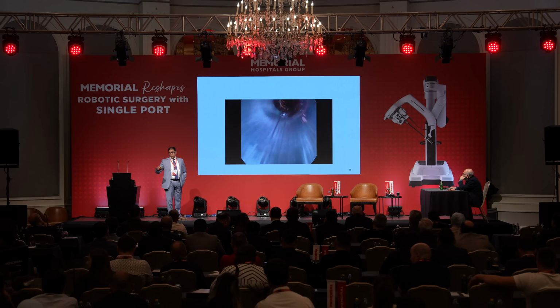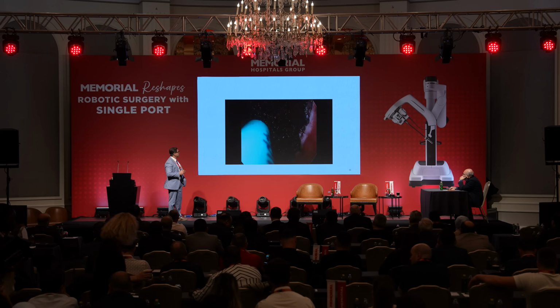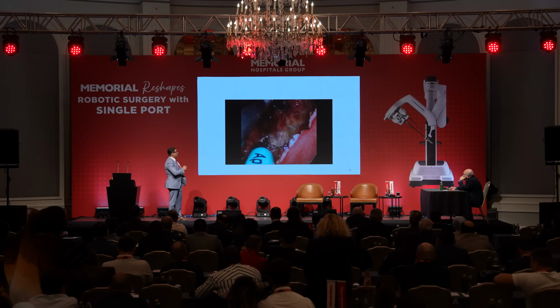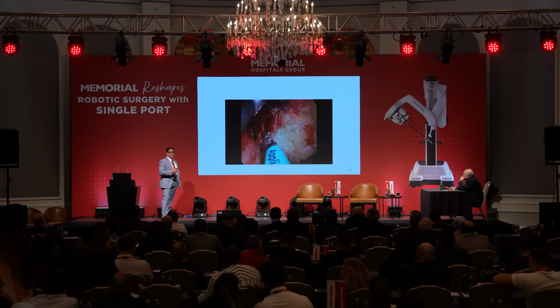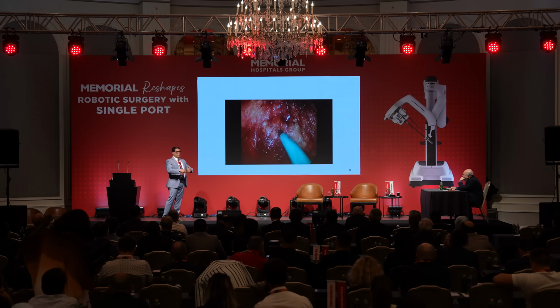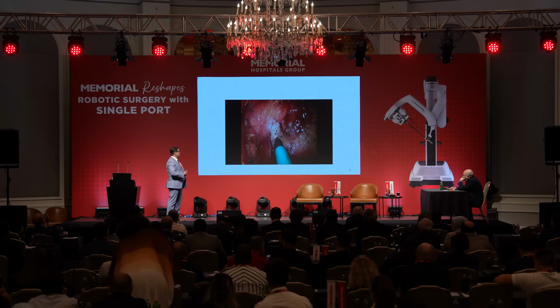And I don't have control to go forward, so I apologize. It's going to take a minute, and then you're going to see good stuff, or better stuff. And now I'm taking something called the anococcygeal ligament, which actually starts in the pelvis with the confluence of the pelvic floor, like the rectus abdominis and the linea alba. This is something equivalent to it.